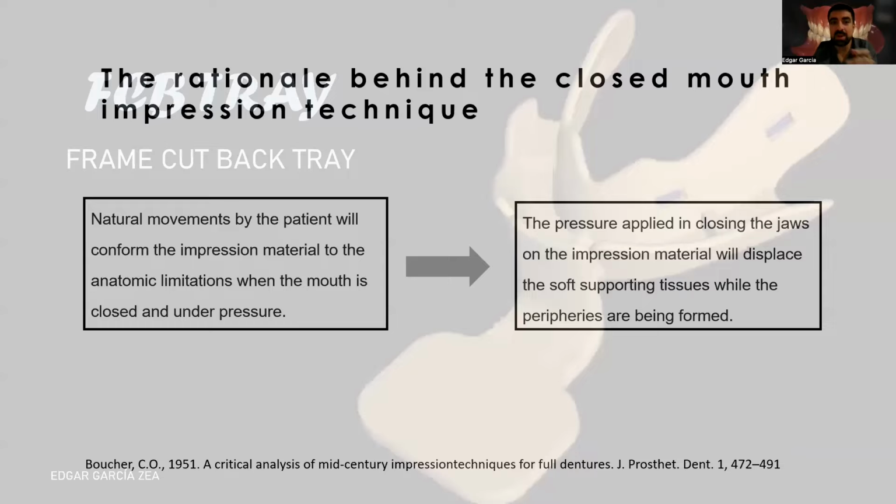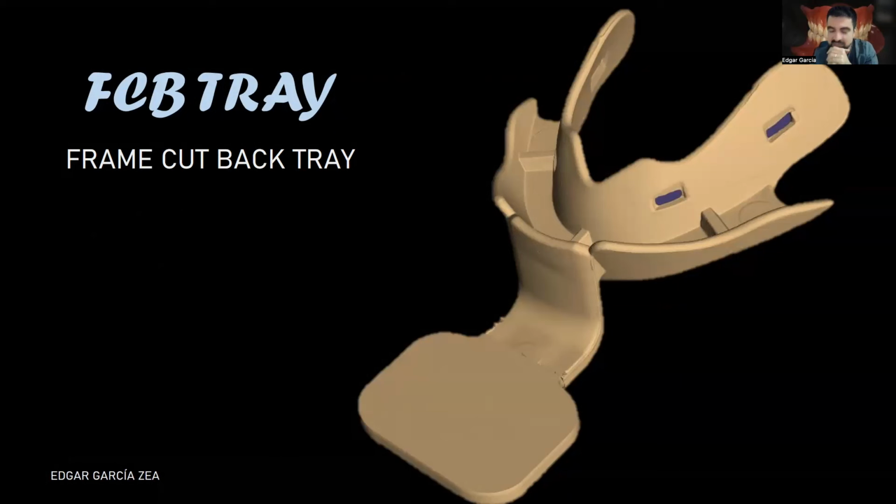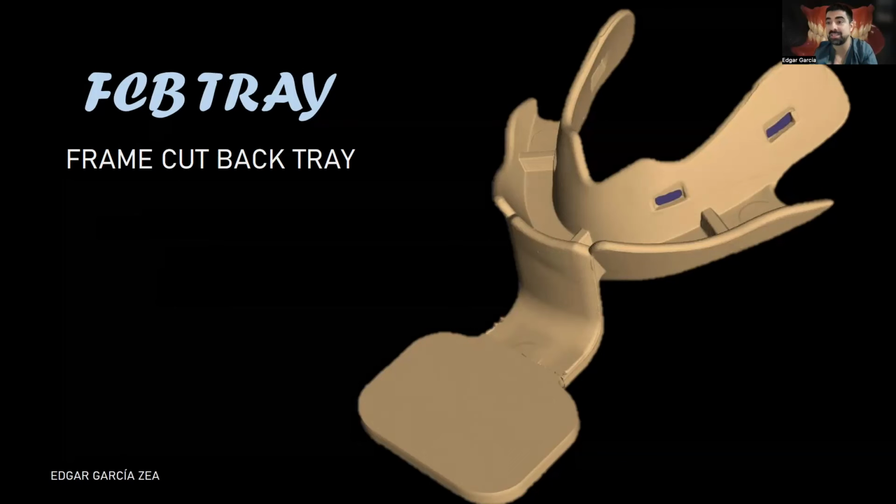But what I think is the most important part of our treatment is the preliminary impression that we are going to take in our patients. I do scans with my intraoral scanner, but it's not going to replace this step. It's more important in the lower one because, as we know from experience in our practice, making the maxillary denture is easy, okay? But with the lower ones, I cannot skip this step, okay?